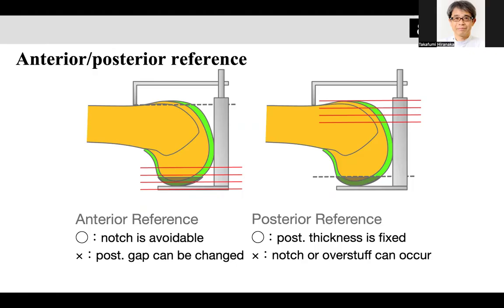Of course, the distance is not digital, but very variable. So sometimes the sizing is between the sizes of the femoral component, such as between A and B, or 3 and 4. So how do we manage this situation? There are two techniques.